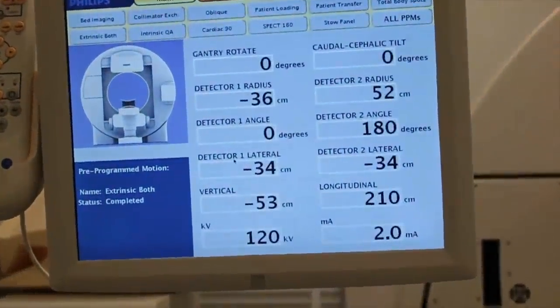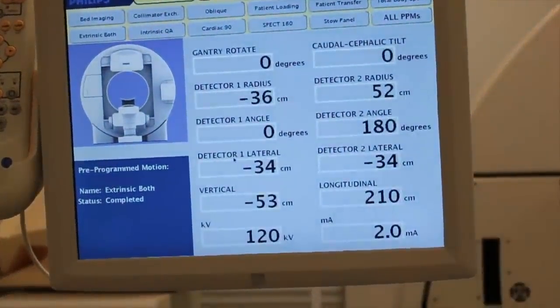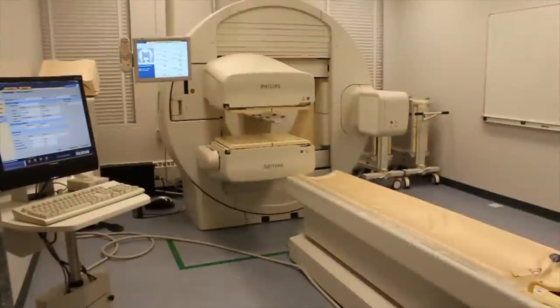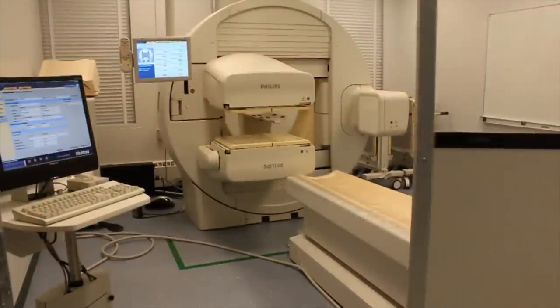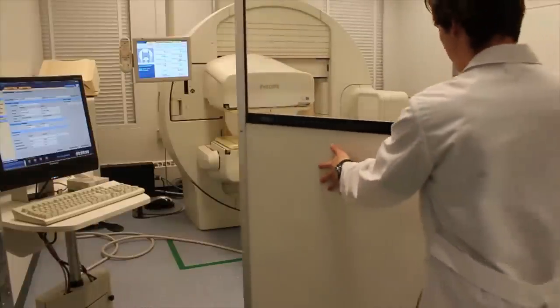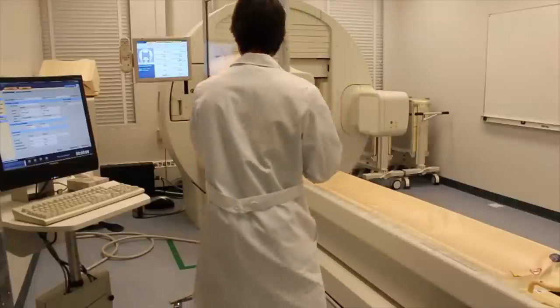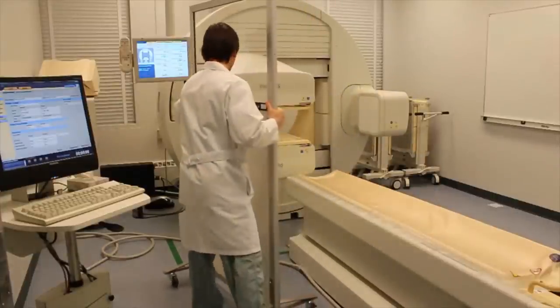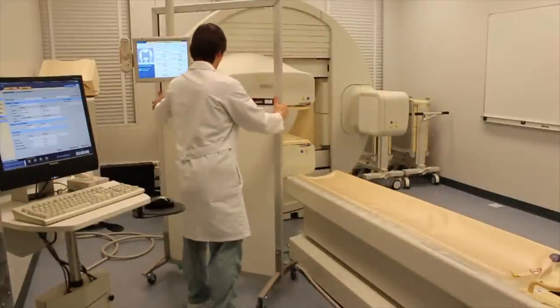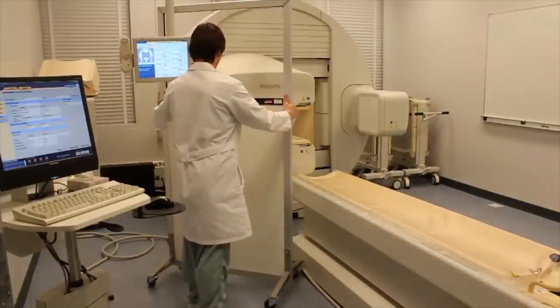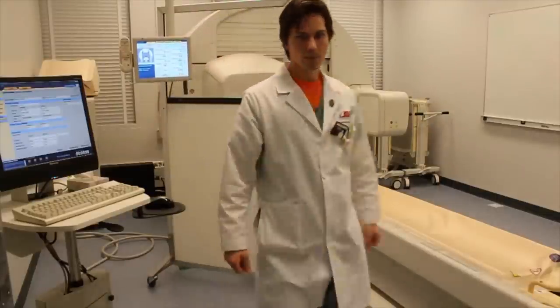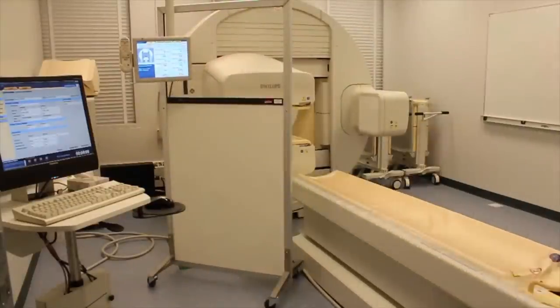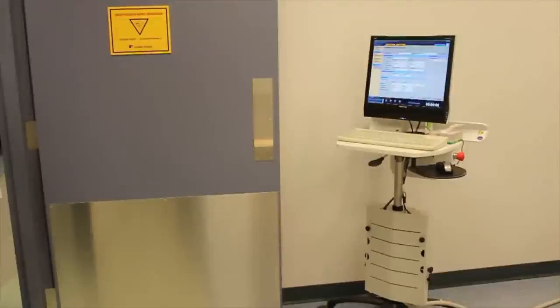Observe that the system has completed the pre-program motion. Utilize the mobile shield by placing it near the detectors. It is appropriate for the extrinsic test, since the scatter will not affect the flood acquisition.